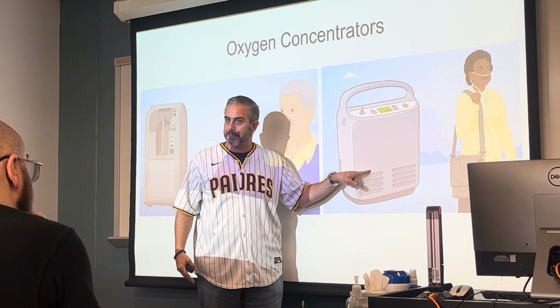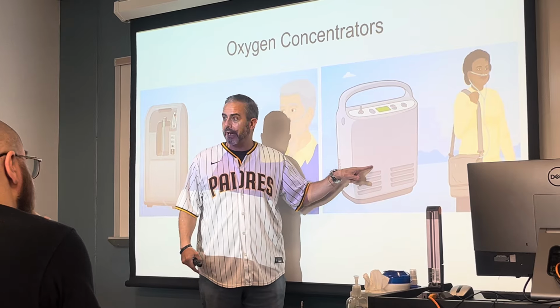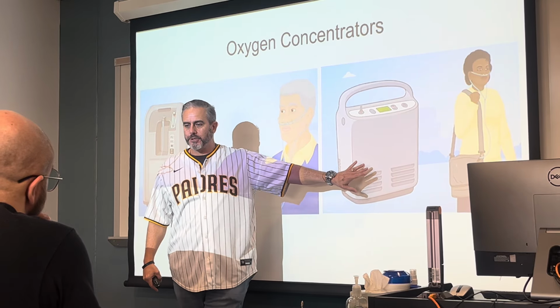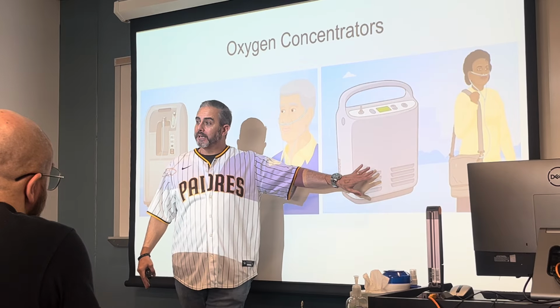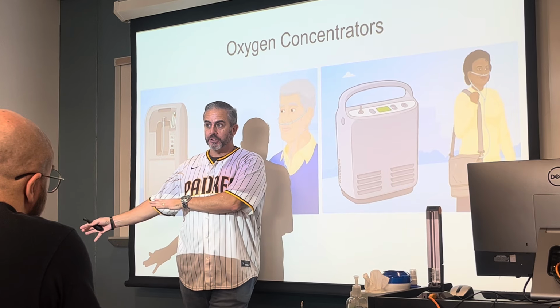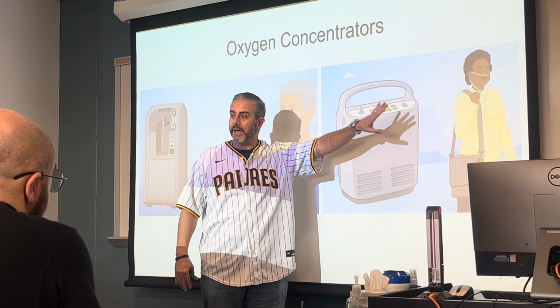Now what powers this? It's not gonna be plugged into the wall, but batteries are gonna power this. So I would always say this for a patient: batteries do die from time to time. Always bring a backup. So you can have one plugged in charging while you're out today, using this for the next several hours.